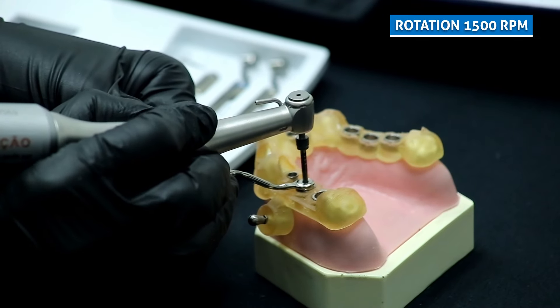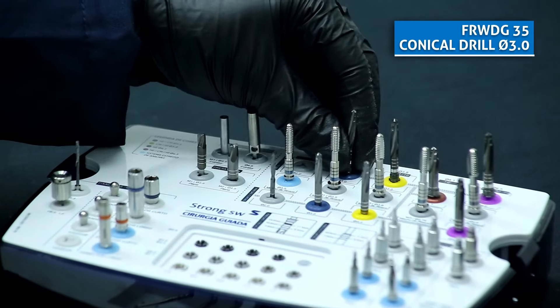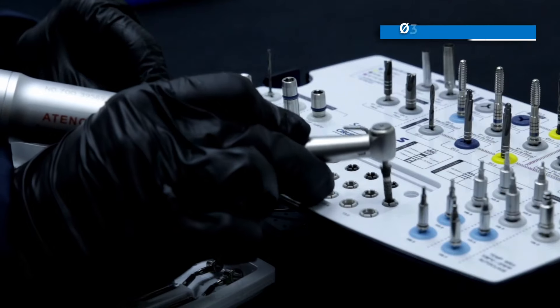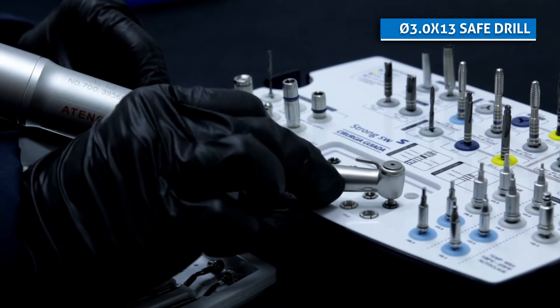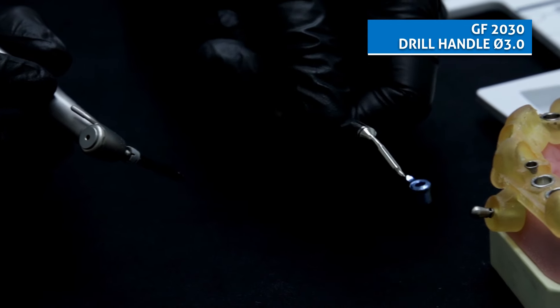With the drill already positioned inside the sleeve, start the rotation. The next is the conical drill 3.0. Fit it to the hand piece, select safe drill stopper 3.0 per 13mm, and with the drill guide 3.0 on the other end. Fit it to the guide sleeve and repeat the drilling.